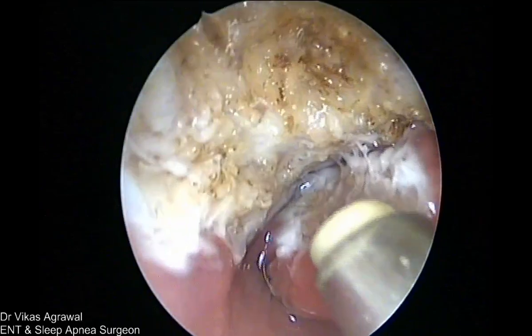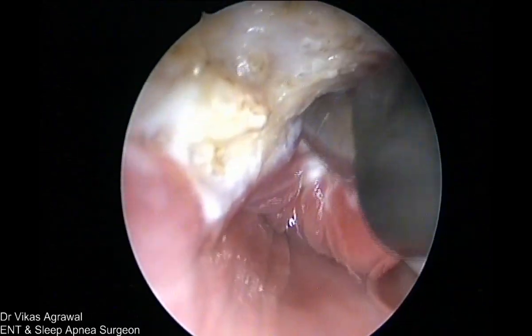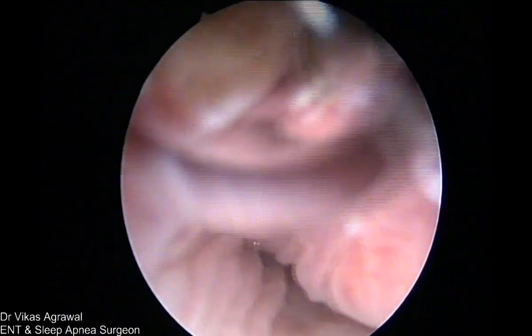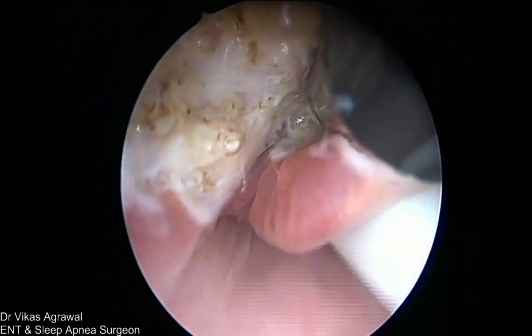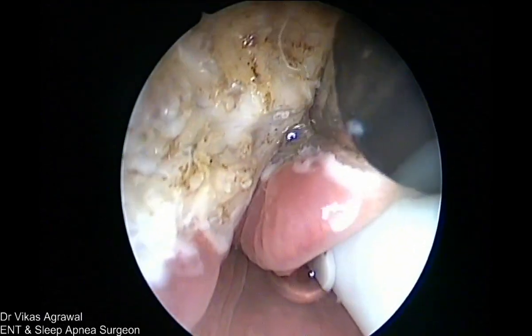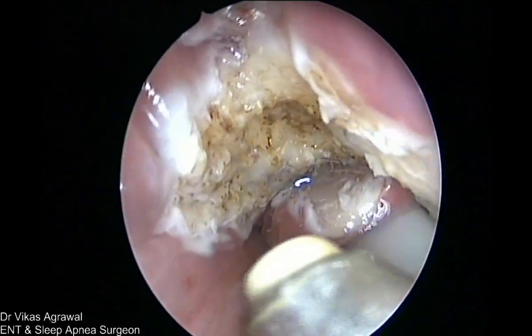Correct. Can you see that? Yes. That's the median glossoepiglottic ligament, which I am going to go and coagulate completely. No mucosa, because mucosa cannot cause fibrosis. So this mucosa I am only coagulating, so there is no bleeding.